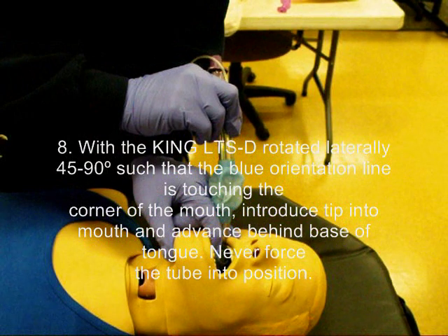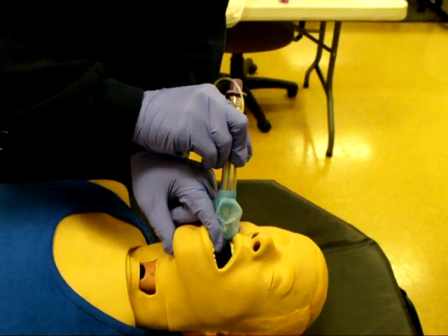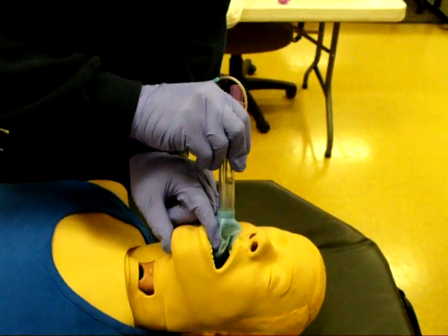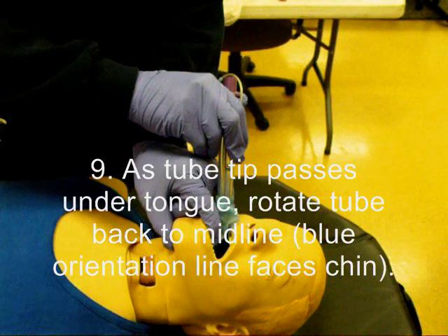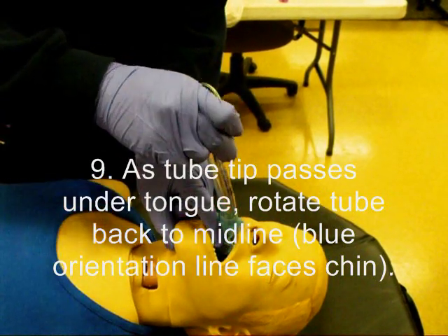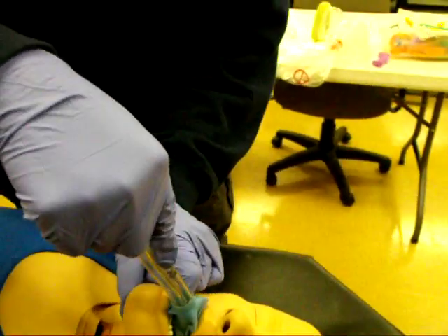introduce the tip into the mouth and advance behind the base of the tongue. Never force the tube into position. As the tube passes under the tongue, rotate the tube back to midline so that the blue orientation line faces the chin.